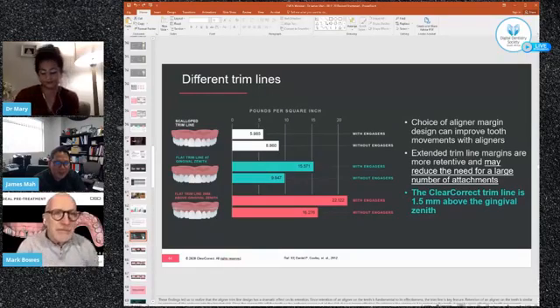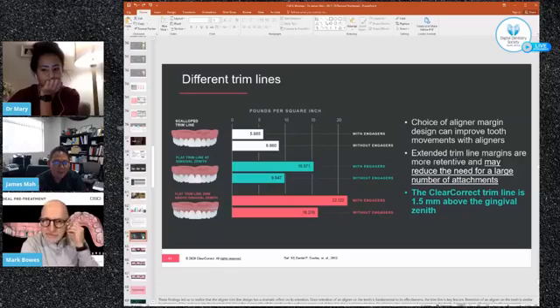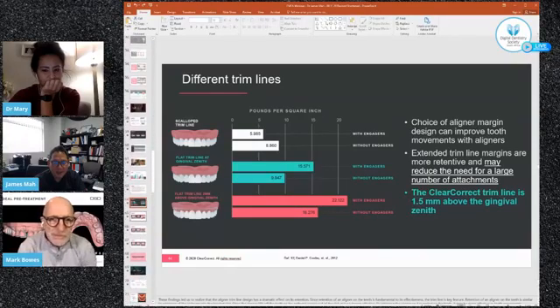1.5 millimeter is not that much. If you take out your millimeter ruler and you look at it, it's not. But the idea is it's the 1.5 millimeter extension that is on every tooth going around the arch. If you go around the arch, then collectively it makes a difference. An analogy I have is when people tell you the water level in the ocean has risen by 1 inch. A person would say, well, 1 inch is not that much. Well, yes, it is on that kind of scale. And so that's how the trim line works. Every tooth being extended adds to the collective retention of the appliance. And when you're able to do that, you get much more retention and thereby allowing the appliance and the plastic to work as you planned, and you can eliminate a lot of the attachments.